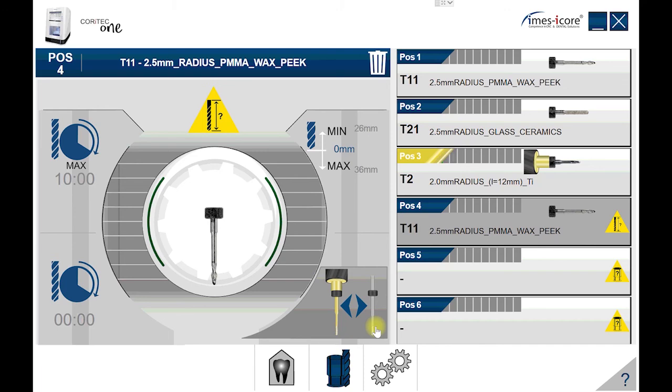This will take you back to the tool list screen, showing you all the tools you have in the machine. And this new tool we just added is now in there too. To clear the measurement warning, we need to have the mill pick up the tool and measure it. This will populate the actual tool length for us.